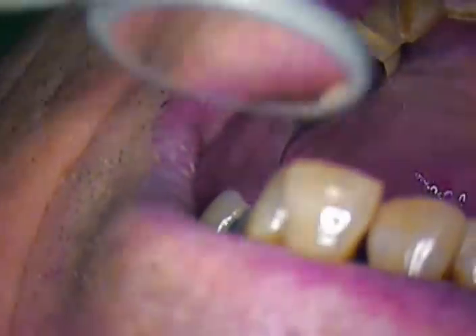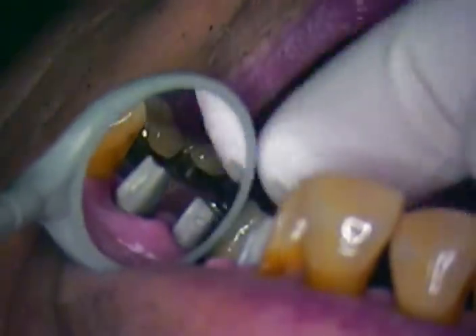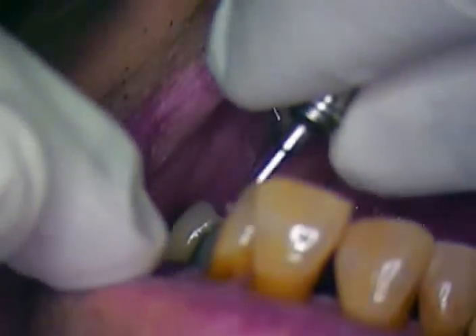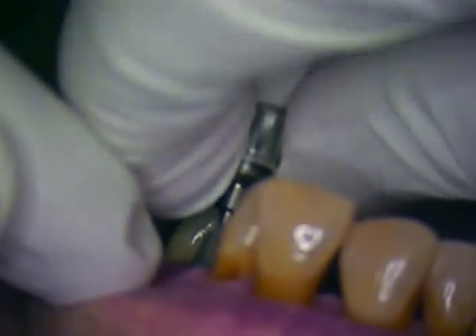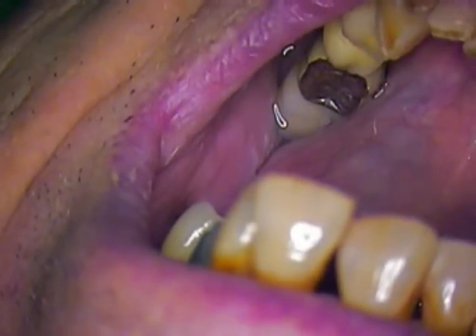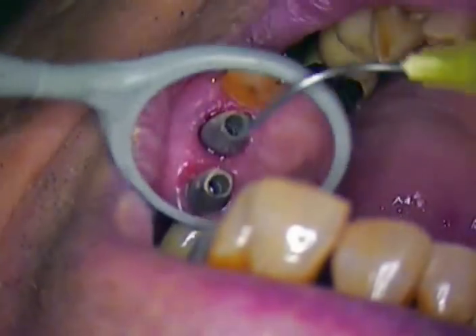So the first one I put in had a slash, the other one is a dot. Double check: the first one is number 11 slash, dot on 12 — so now you know. I'm going to hand tighten again. You always want to take a post-operative x-ray after you tighten down the abutments — before you cement your bridge, take an x-ray, take a bitewing x-ray, because you want to make sure you've got a perfect seat.